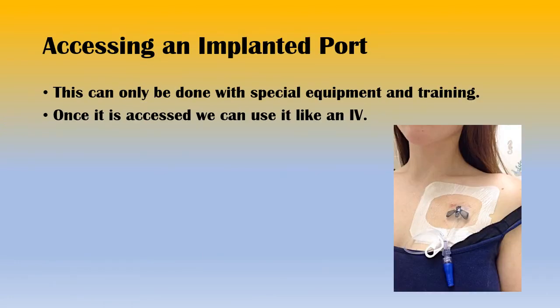Accessing an implanted port or a power port can only be done with special equipment and training. It's actually a sterile procedure where they go and access this port, not something that we're going to be able to do. However, when that patient goes to the outlying hospital, they access their implanted port, then we can take that and use it as an IV while we're doing the transport.